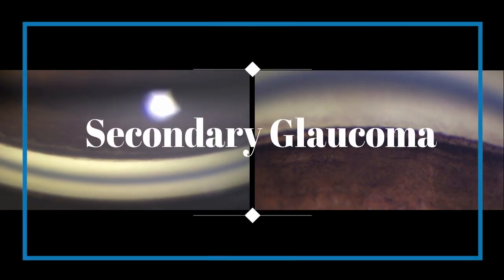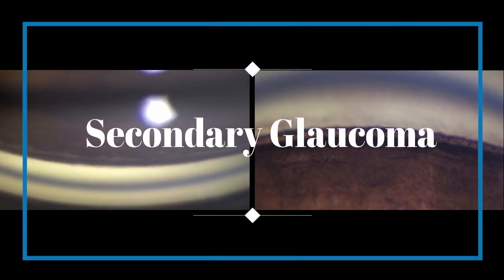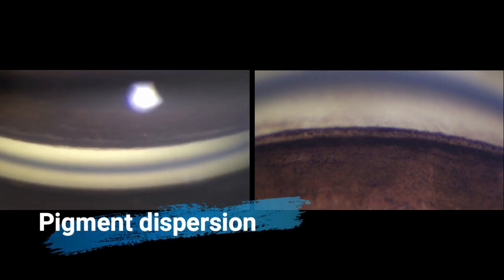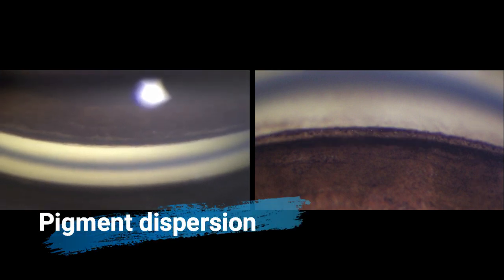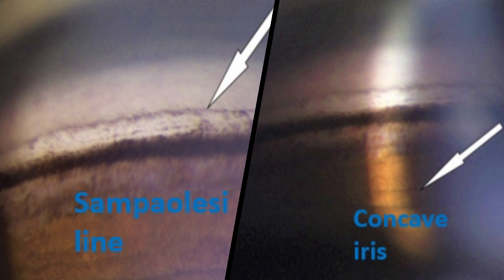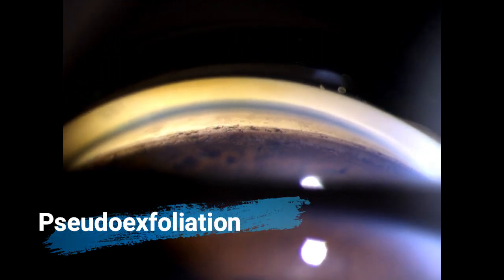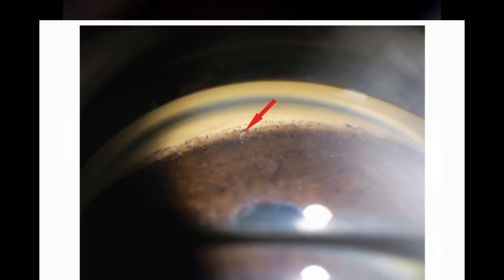Secondary glaucoma, where we see patients with pigment dispersion syndrome, where there is liberation of pigments from the iris which get deposited anterior to the Schwalbe line. Here we can see the Sampaolesi line and the concave iris appearance. Pseudoexfoliation syndrome, where we can see white powdery deposits at the angle.